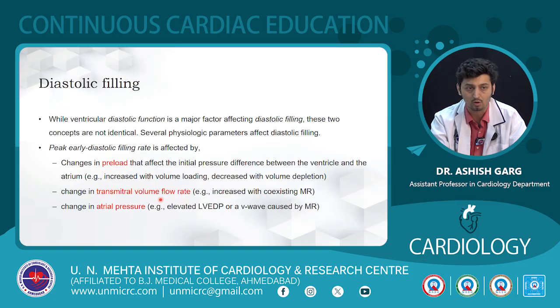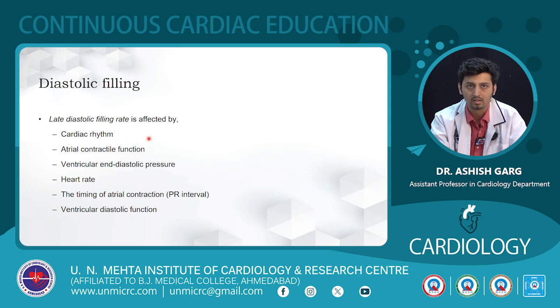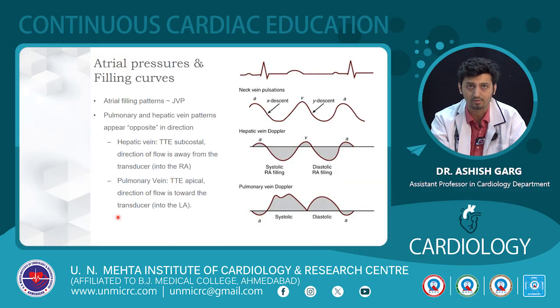It is also affected by change in transmitral volume flow rate, that is increased with coexisting MR, and change in atrial pressure, that is due to elevated LVEDP or a V wave caused by MR. The late diastolic filling rate is affected by atrial contractile function, the timing of atrial contractile function, the ventricular end diastolic pressure, and the ventricular diastolic function.